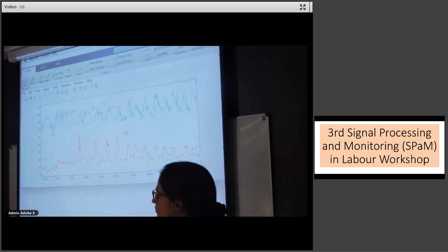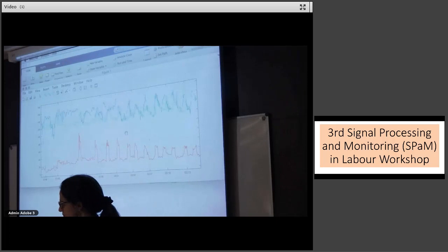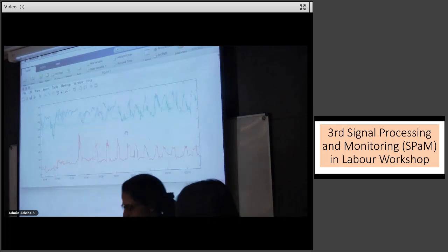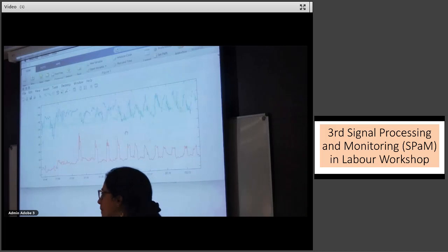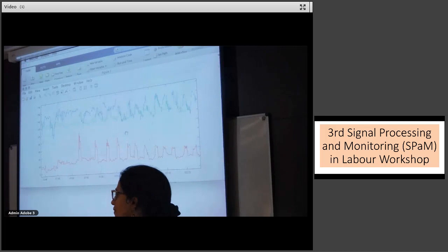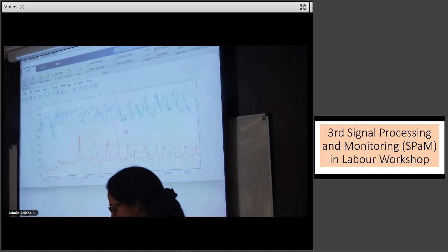One of the great concepts for fetal monitoring was this notion of the basal rate. Basal rate is defined as, in this case, the 120 or 110 with normal variability, and I believe it should be plotted for the whole labor. So you plot that, and now you can create a delta at any time. It is the strangest physiologic notion to define the baseline as what the heart rate is now. That's not physiology. If I jump up and down and my heart rate goes up, nobody would call that baseline.